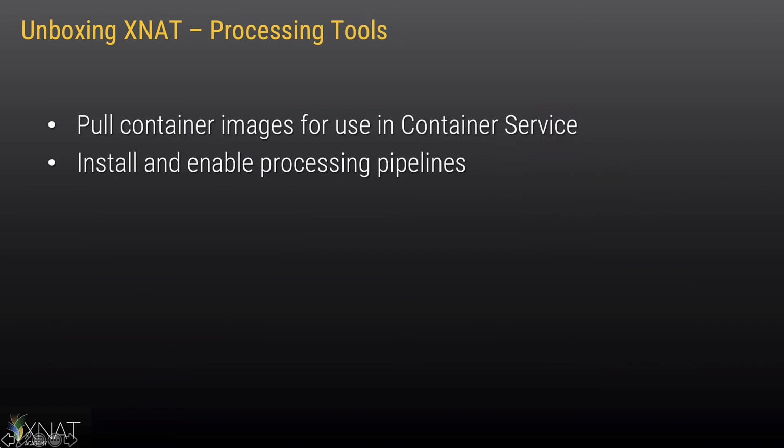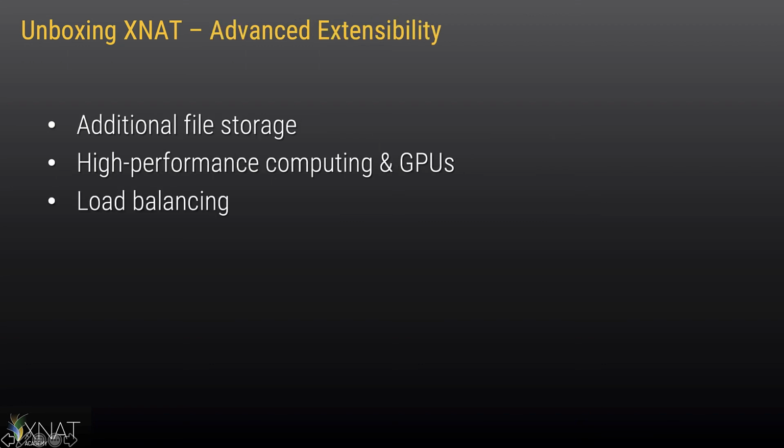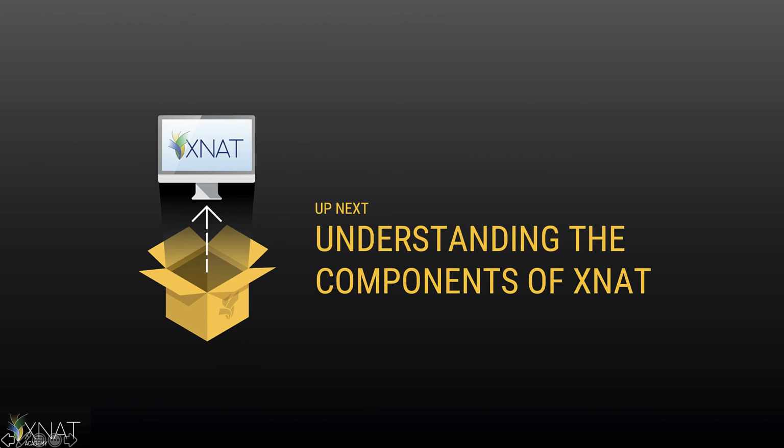XNAT also allows you to add modular data processing capabilities, whether you're using the container service or the legacy XNAT pipeline engine. And advanced XNAT deployments allow you to add massive file stores, or connect to high-performance computing, or deploy multiple load-balanced front-end servers. The sky is really the limit. And this is really just the start of what you can find and do within this platform. Keep going to learn more.